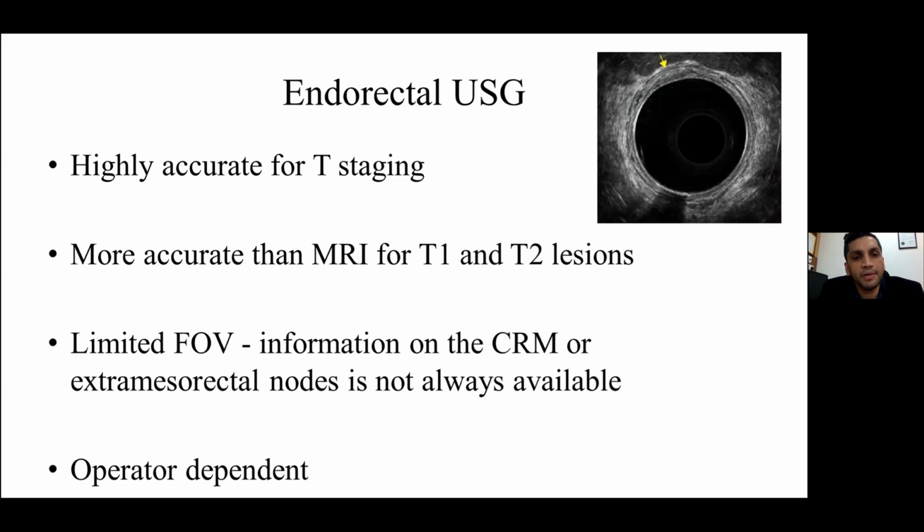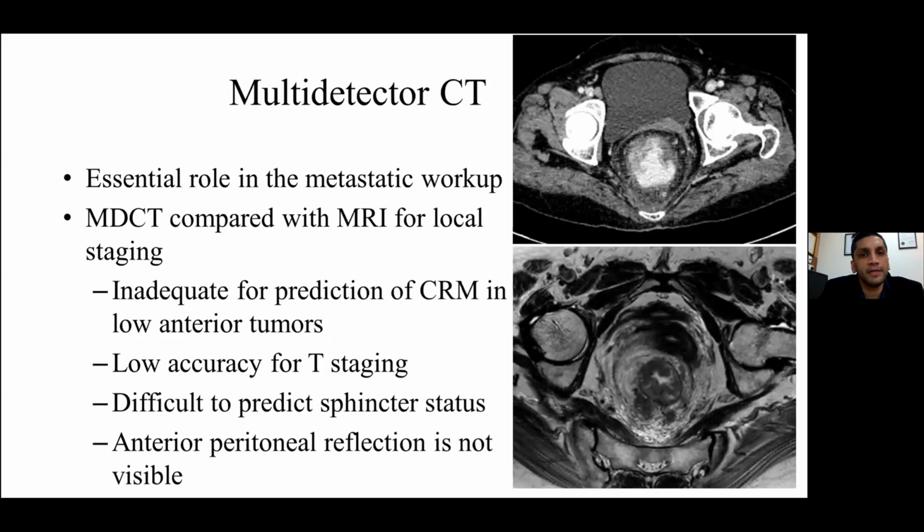However, it has a limited field of view. Therefore, the information on CRM or extra mesorectal lymph nodes is not always available and is actually operator dependent as well. CT is a useful modality. However, it is mainly used in the metastatic workup.